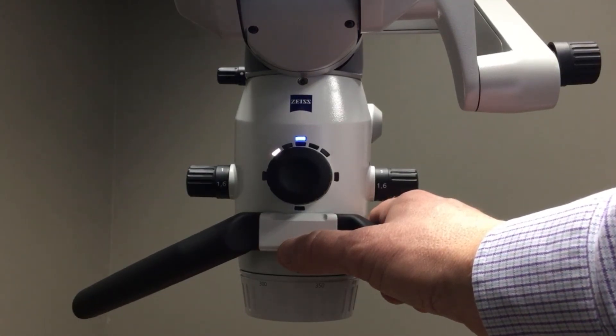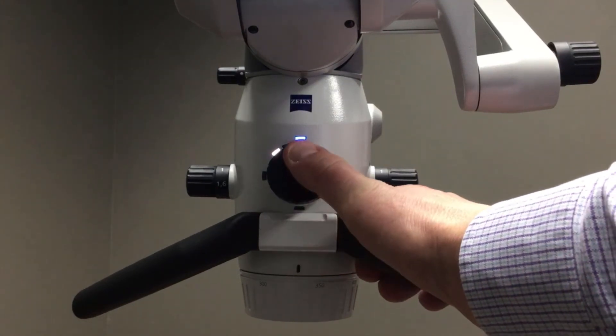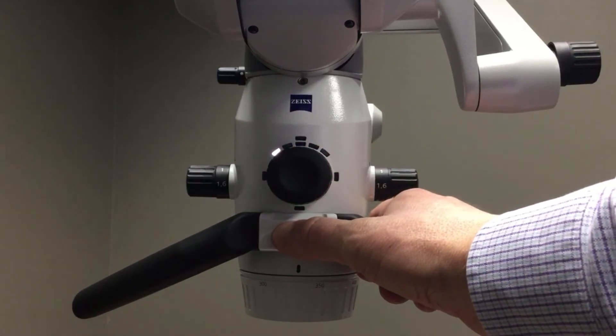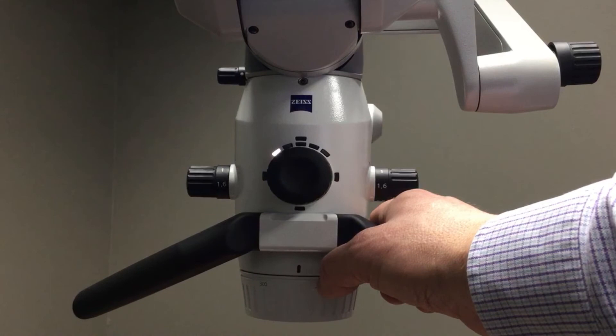you're not going to get the reflections and the hot spots on the tooth, which will also provide a more aesthetically pleasing image or video for the patient or the referring doctor that you're sending your case back to.